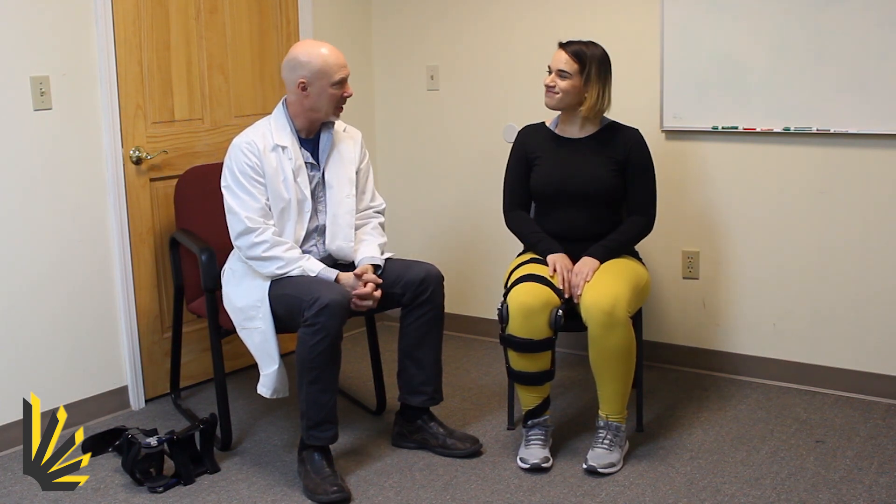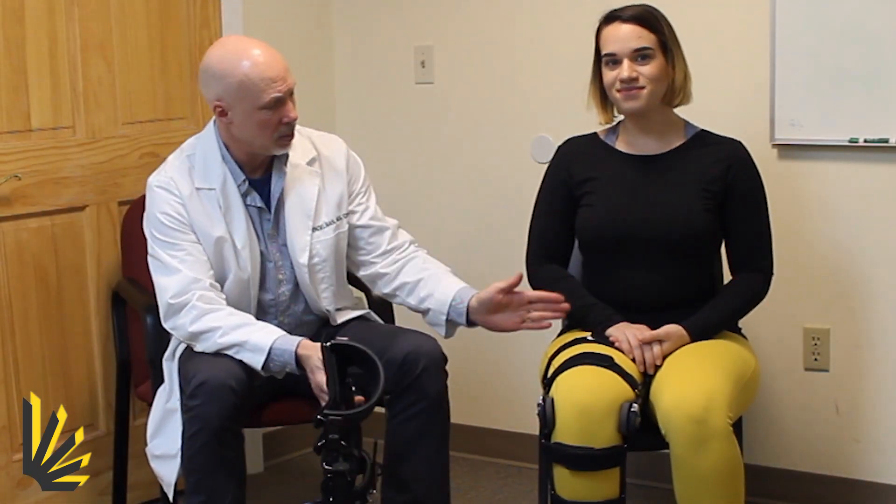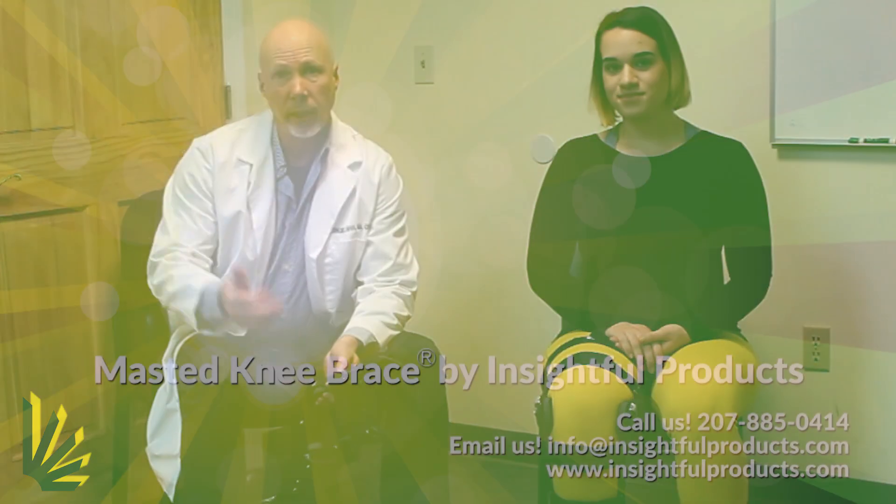All right, well thank you very much for helping out. The Masted Knee Brace is available online — simply take a measurement at the thigh and the calf, give us your shoe size, and you can order one right here with this link.